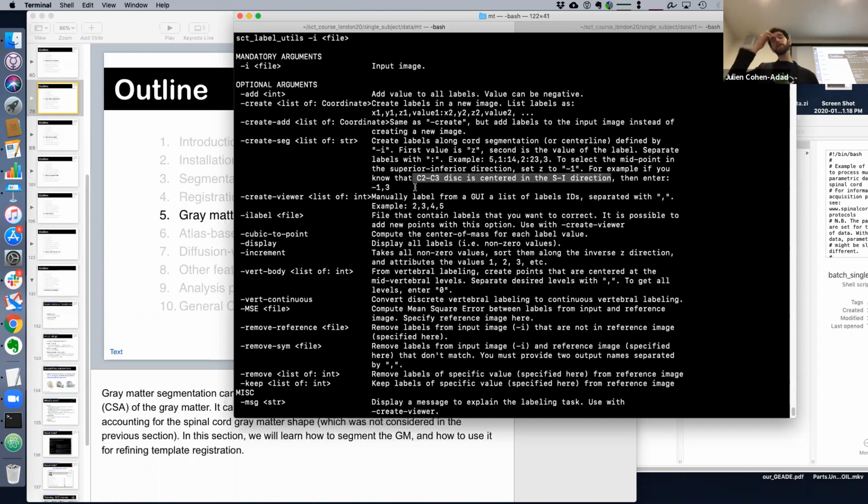It's a good question. One way would be to look at spinal cord specific markers, like the cervical enlargement, for example, as a way to position yourself always the same way. Or the pontomedullary junction, even though it might not be the same down the line. That's a very good point. You mentioned the radial diameter, so see what variation happens with different positions.